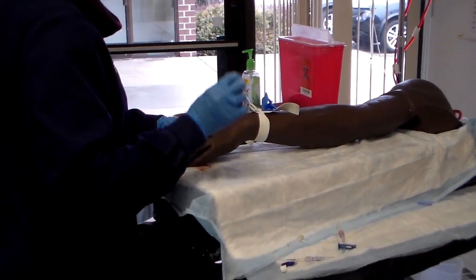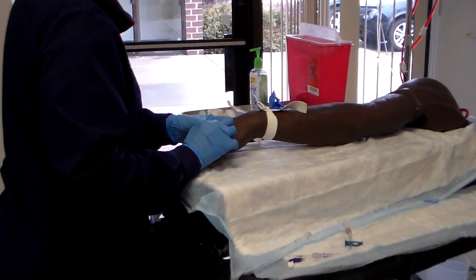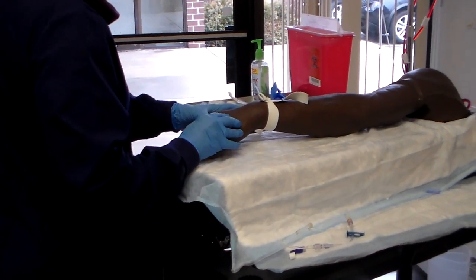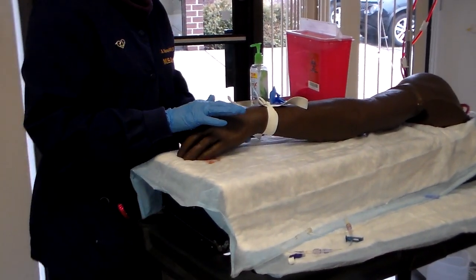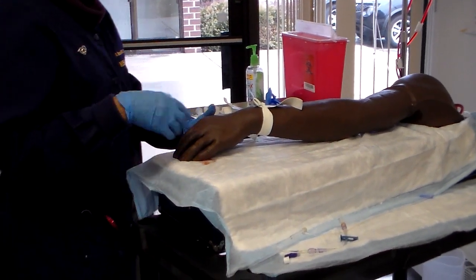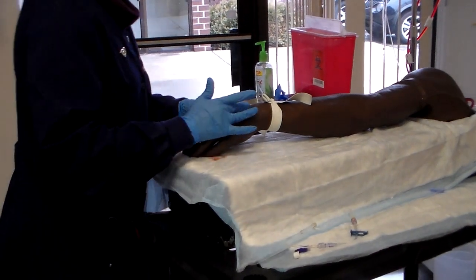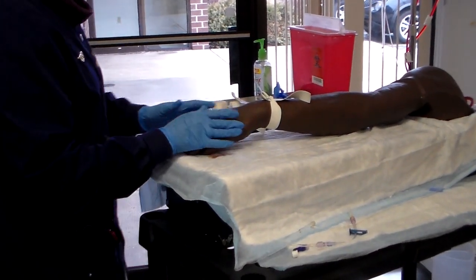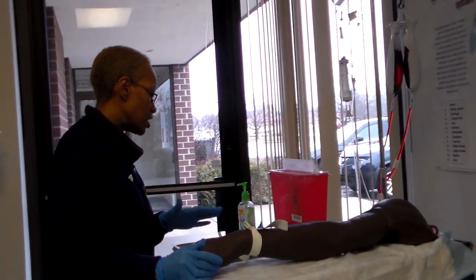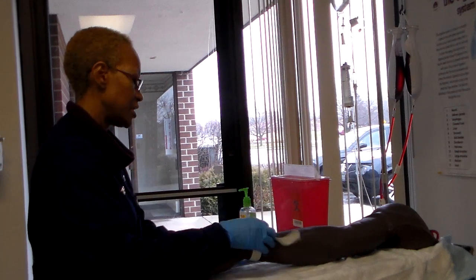And that's a skill that you'll have to develop to get your fingers nice and sensitive to the feel of veins. Because sometimes you'll feel them and they'll feel hard because they've used those veins over and over again. So that's not one that you would use. You will go up a little bit higher. Okay? All right. So once we've discovered our site, then we're going to release the tourniquet.